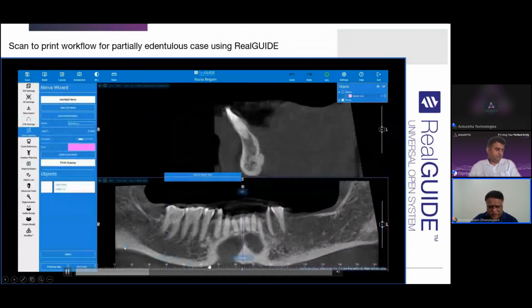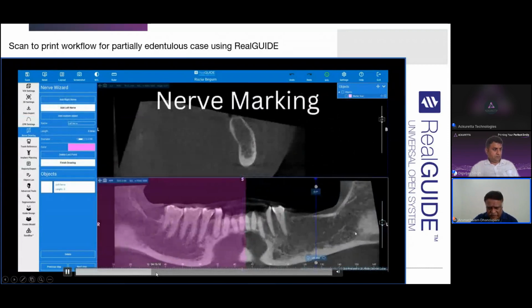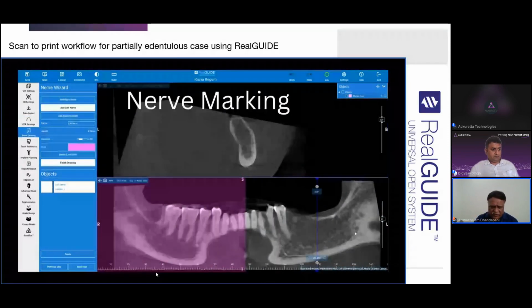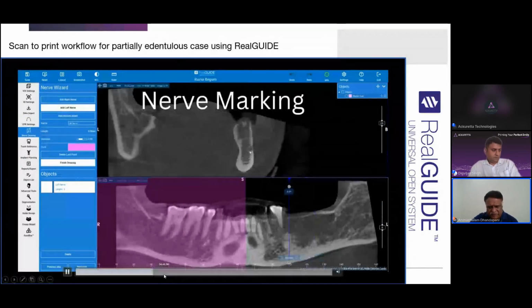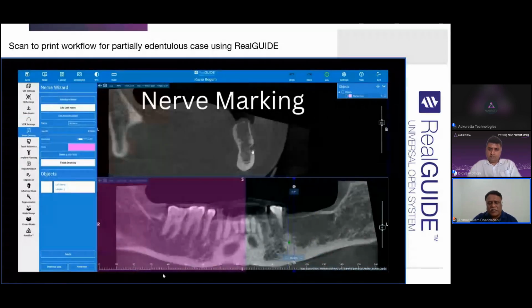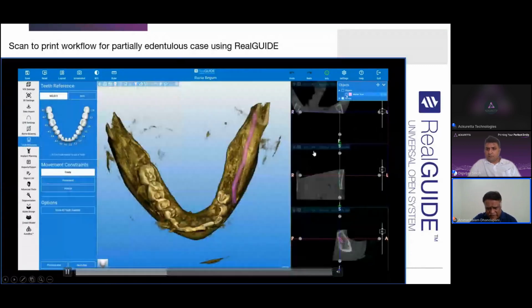And then the process is just the same 7 steps. We look at first identifying the nerve, and once we trace the nerve, we convert that into a solid model. So we are able to convert the nerve structure itself, the realistic representation of the nerve structure, into an STL model, and we can transmit the model over the internet to other systems or to other software. So you see here that the nerve has been identified and has been generated.